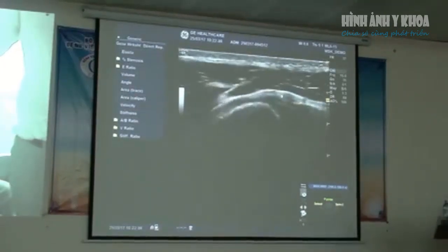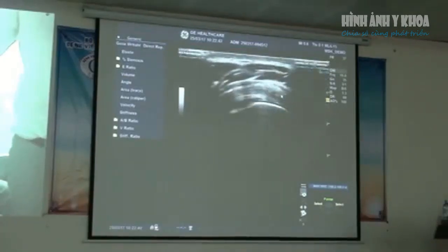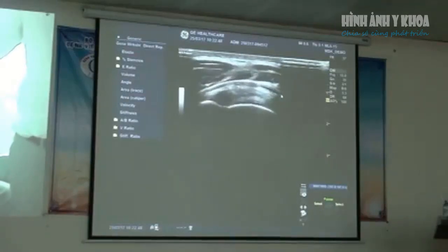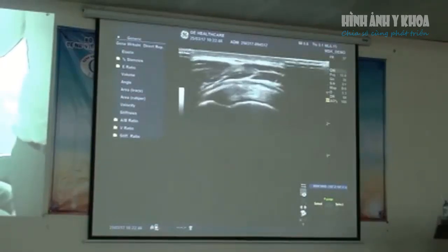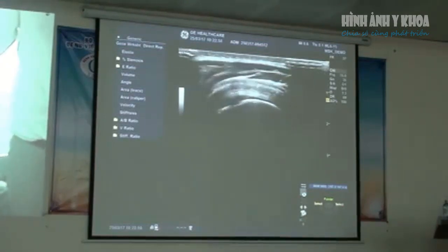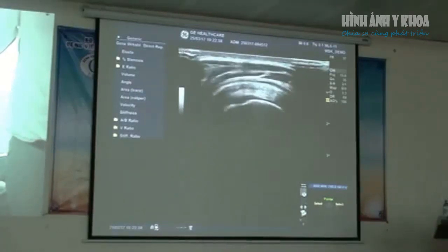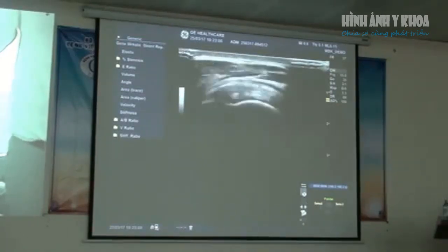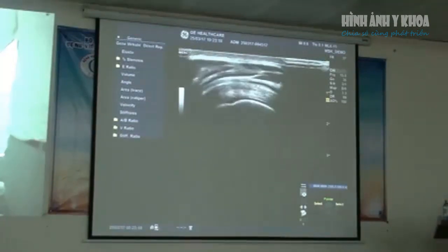At this point, I would ask the patient, is that sore when you bring your arm up? No. So remember that the bursa is a normal structure. It's there as a protective mechanism. It's only when they start to get thick and filled with fluid that they don't function properly. So a little bit of fluid is okay. A little fluid is physiological, while more fluid that limits movement is pathological.